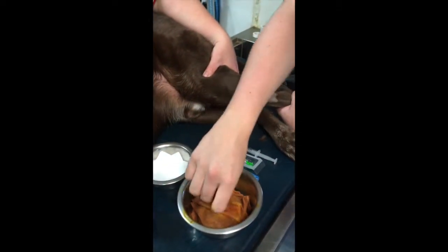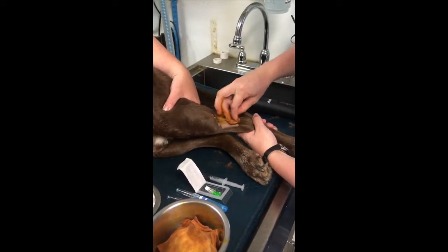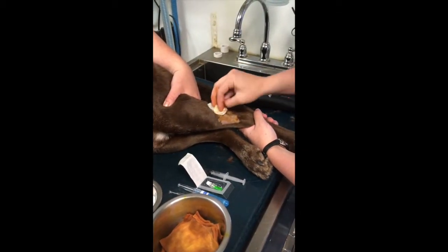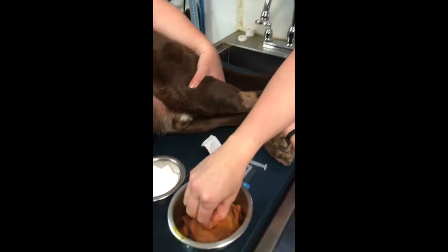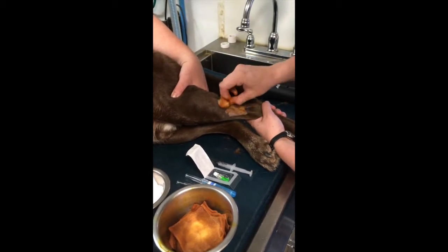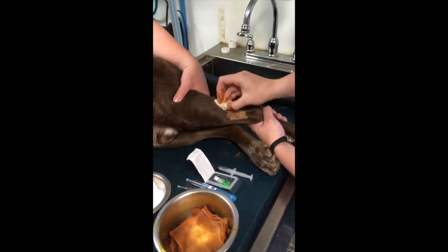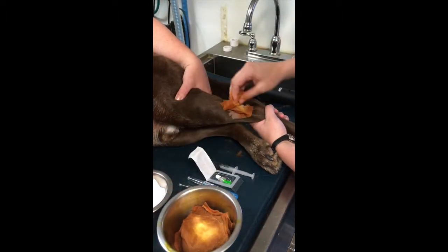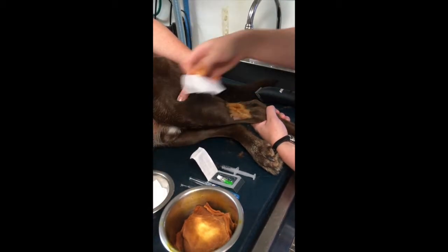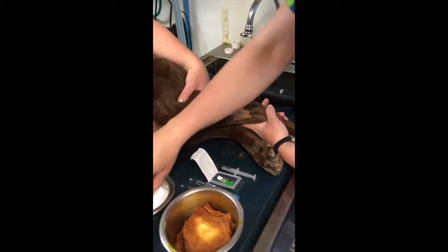I'm going to do 3 scrubs with betadine, 3 scrubs of alcohol, all alternating. All right, I'm going to do one last alcohol.